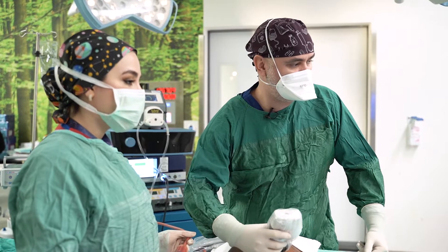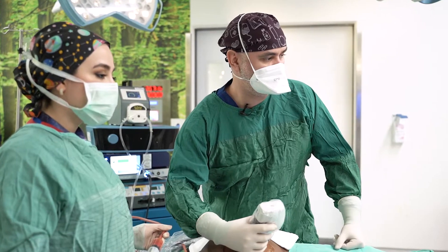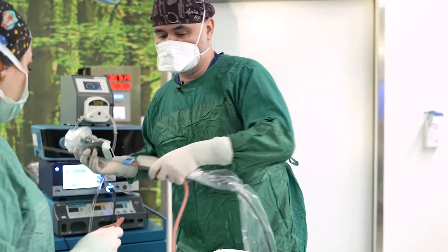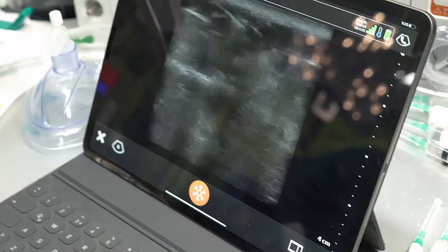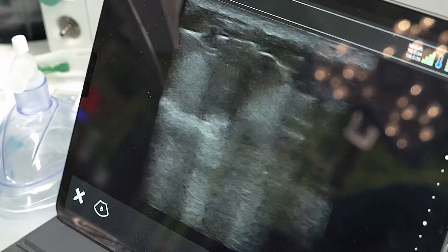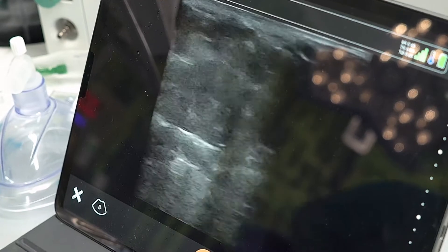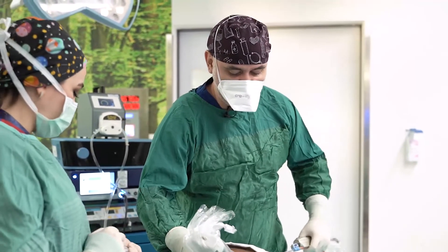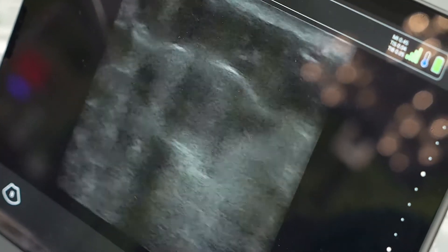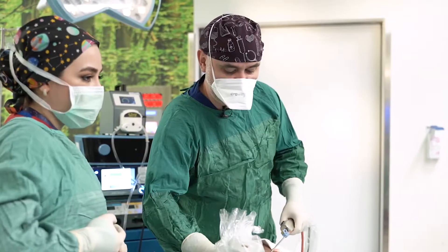We use an ultrasonic device to check the exact plane where we inject the fat. You can see this area and which part of the space we are injecting into. We also inject the fat with the power-assisted system. You can see the space — now I will inject the fat and fill this area. When we use the ultrasonic device, we know that we are not injecting fat inside the muscle; the fat injection is done only between the skin and the muscle area. That is what defines the safe BBL.